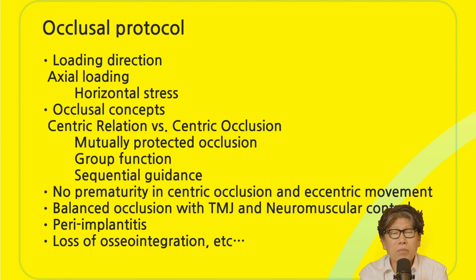How do people get canine implants? When they do canine implants, do they do canine guidance? Canine guidance, you can try it, right? What do you need then? You need a fixture that's as long and as thick as possible so that you can maintain the force of the canine, right? And then what's the point of having a thicker and longer fixture? Then you have to use a very strong abutment connection. But unfortunately, almost all of our domestic implants, so it's a constant problem.